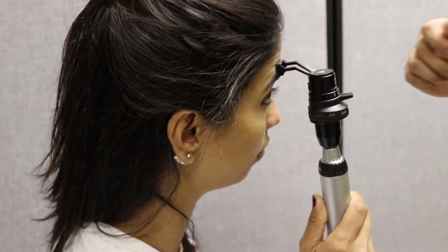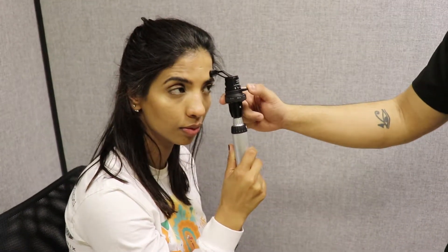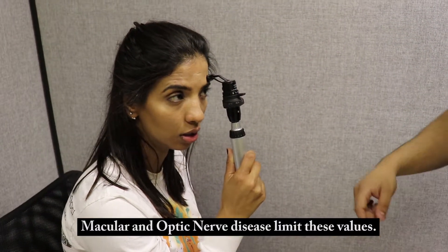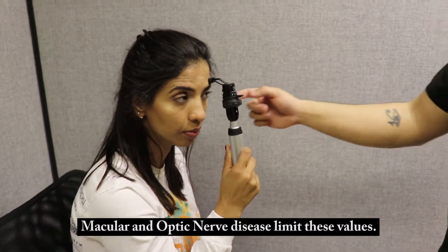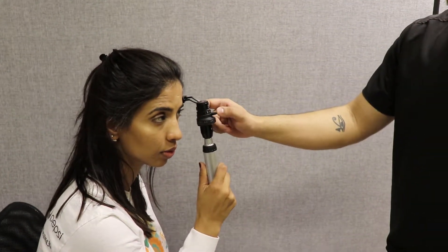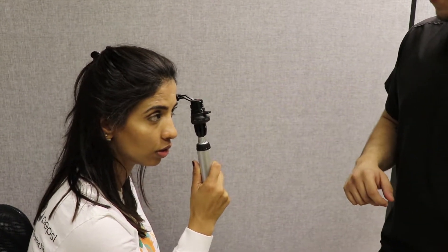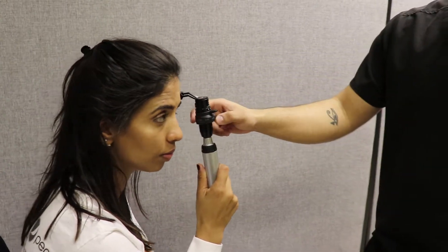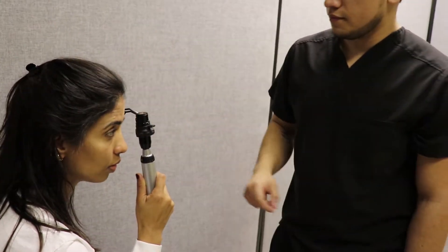So we're going to move over to the other eye here. Okay, so these are horizontal lines. I'm going to make it a little bit thinner here — how about there? They're vertical, but they're slanted. And how about here? A full circle.